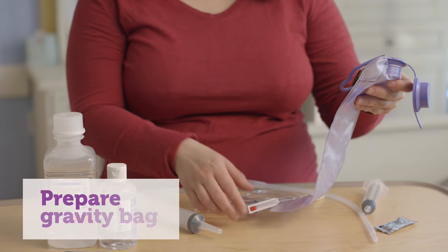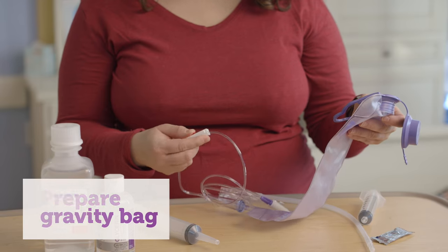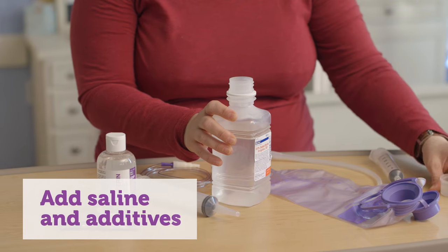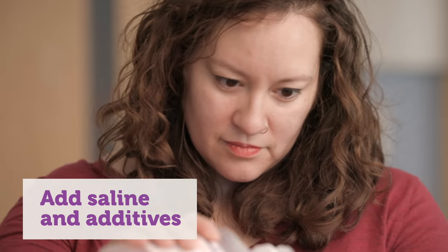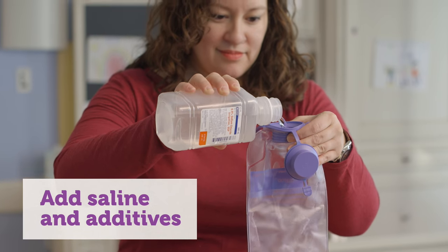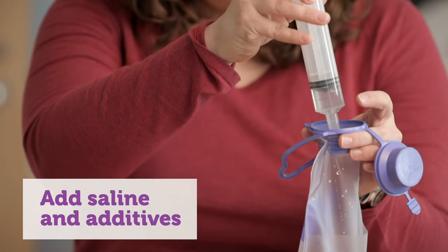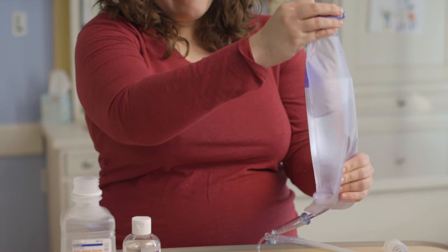Now let's prepare the gravity bag. The bag has a roller clamp that controls the flow of the enema and is what makes it start and stop. Roll the clamp down to clamp off the tubing. Pour the prescribed amount of saline into the bag plus a little extra since some will stay in the tubing. Add in glycerin, castile soap, or both as prescribed. Shake or stir it to make sure it's fully mixed. This will keep the tube from getting clogged or blocked.